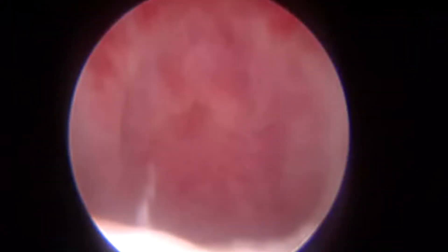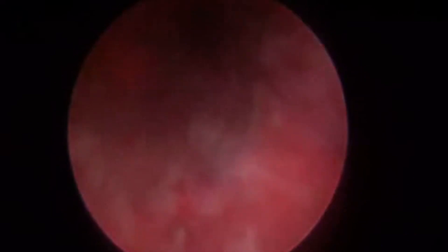This is the diagnostic cystoscopy. As you can see, we are entering the urethra, crossing the verumontanum — that is the dilated posterior urethra — with an elevated bladder neck and a lot of trabeculation.